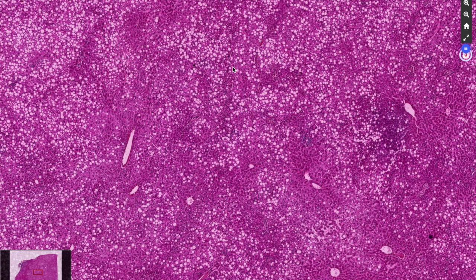The main differential diagnosis of hepatocellular adenoma when you have no atypia is focal nodular hyperplasia, but in this case there was no fibrous scar, no ductular reaction, and so the diagnosis of FNH is very unlikely. And also to confirm this impression, you have to take a look at the glutamine synthetase because it's really easy by immunohistochemistry. The focal nodular hyperplasia will have a map-like staining.